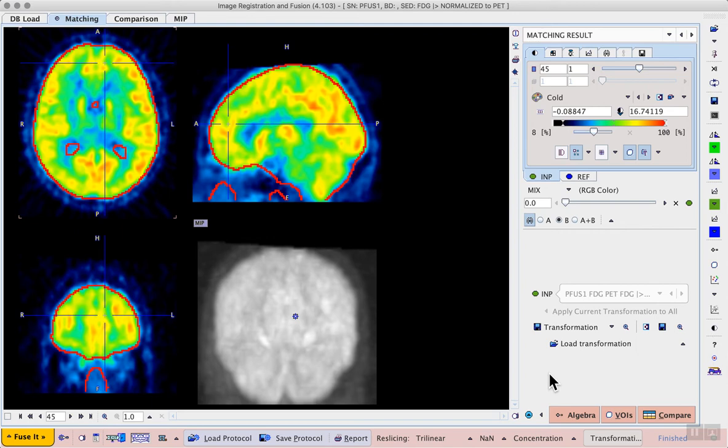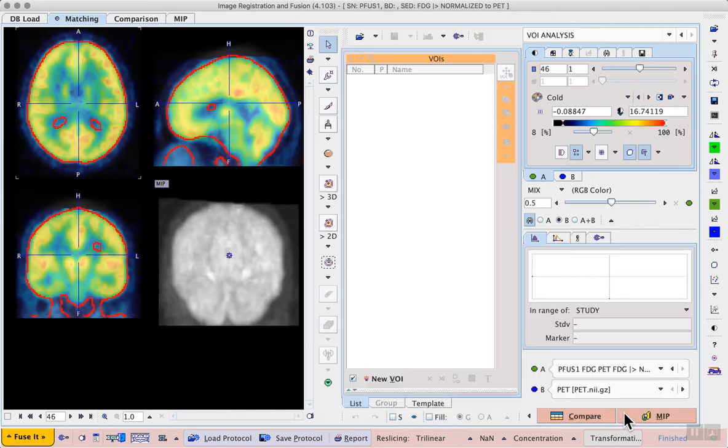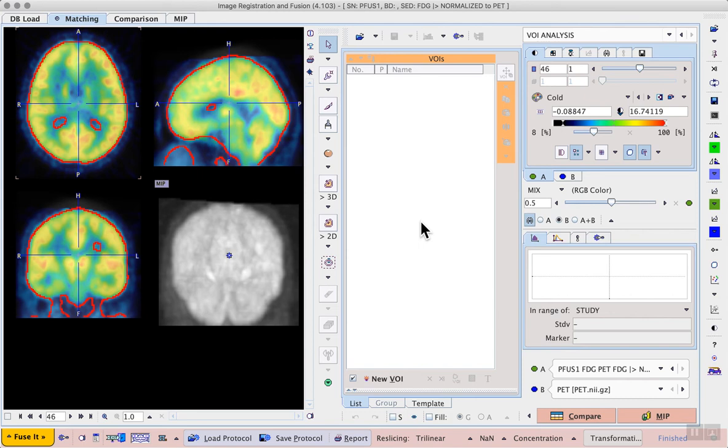Now we can carry on and do some volume of interest analysis so we can proceed with the workflow button in the lower right, VOIs. And here now that we are working in this template space we don't need to draw our own VOIs anymore, we can use the predefined atlases and these are accessible from the template tab at the bottom of the VOI list.